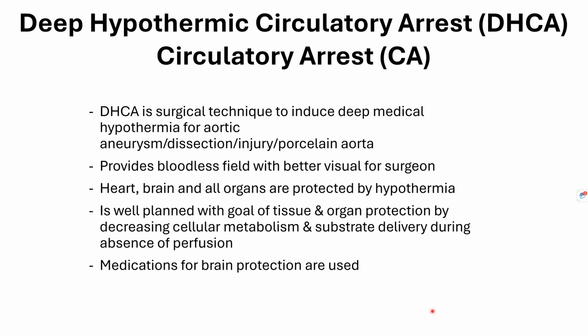It is always going to be a very well-planned procedure before even starting it. So everything is planned, from how to cool the patient, the meds that are required, how they are going to protect the organs, and how long it will be. It's all well planned before it starts, because you want to make sure that all the organs are well protected, especially the brain, because you want to make sure that there's no free radical accumulation, there's no swelling of the brain, there should be no damage to the brain vessels, and the intracranial pressure should stay normal.